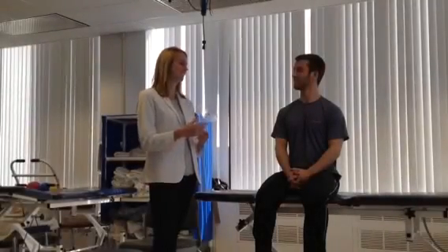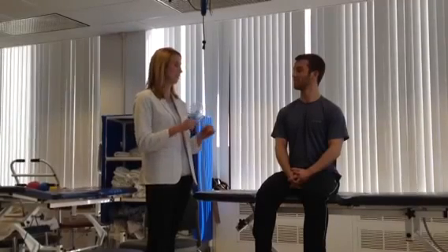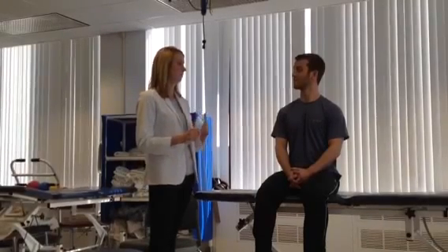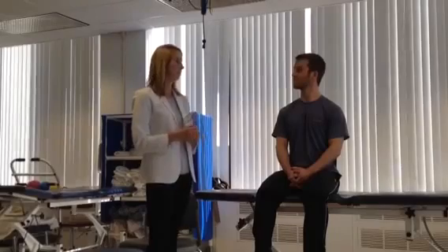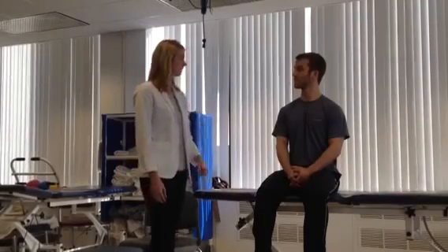Alright, Steve, for this next part, I'm going to measure how well your shoulder moves, and I'm going to use this goniometer to get an angle of how far back I can get your shoulder to go, and that'll help me to see how I should proceed with your treatment, okay? So what I'd like you to do next is remove your shirt so I can get a full visual of your shoulder while I'm taking measurements, and go ahead and lay on your stomach, and I'll have you face away towards the windows. And I'll also have you keep your palms at your side and relaxed.